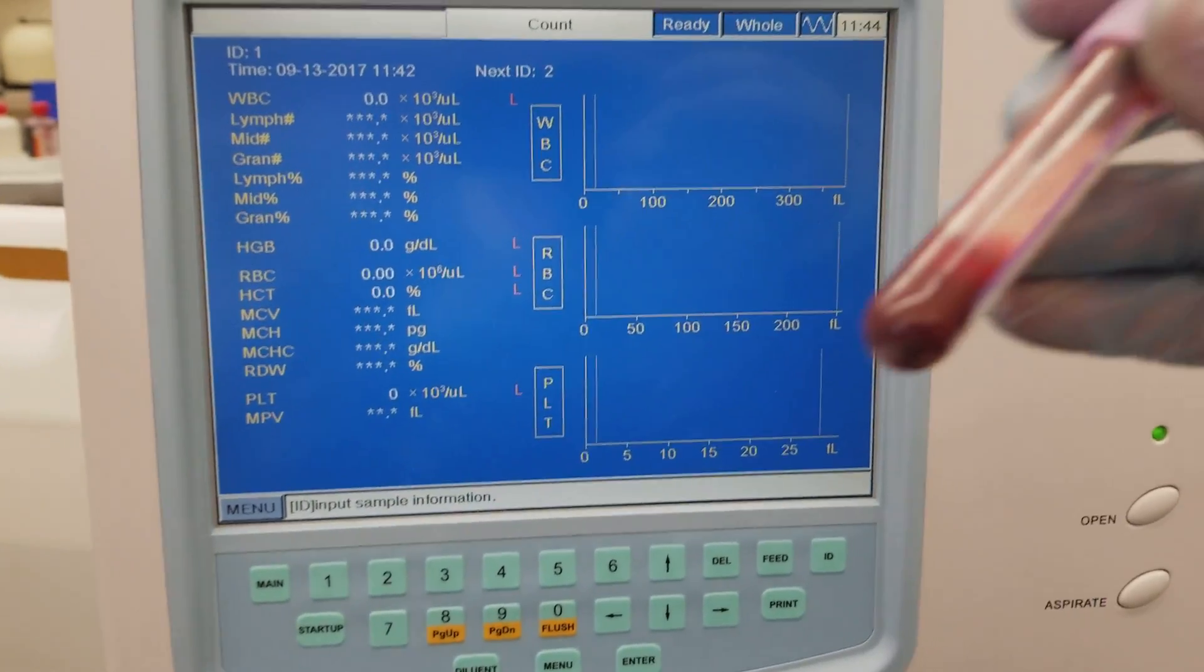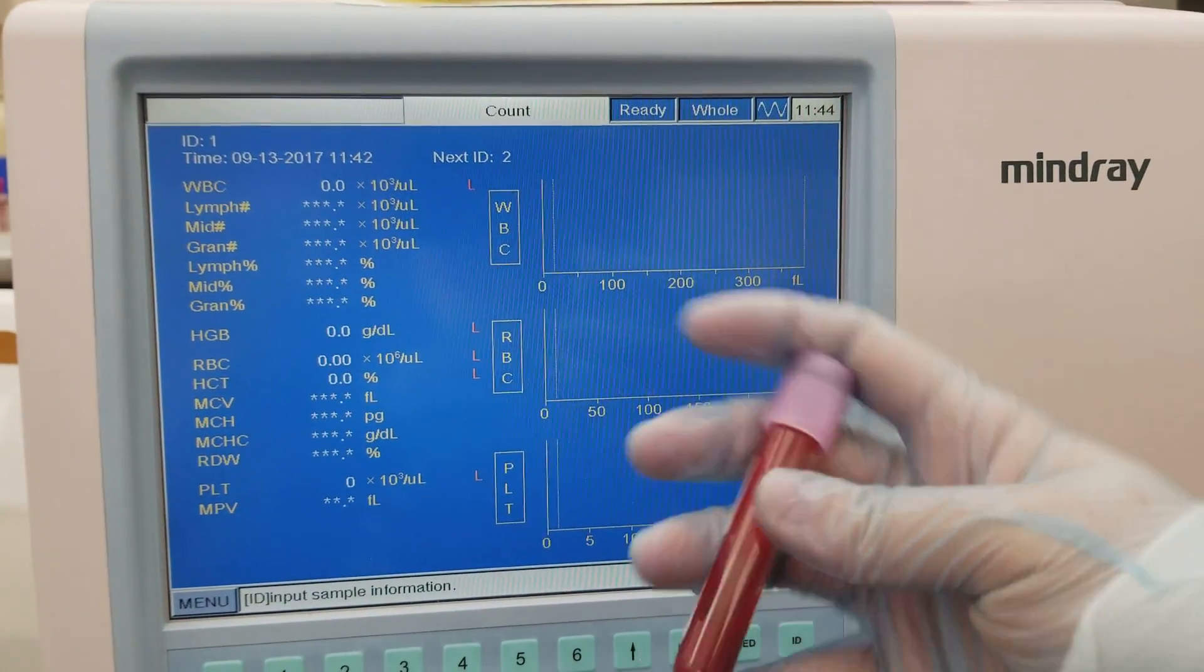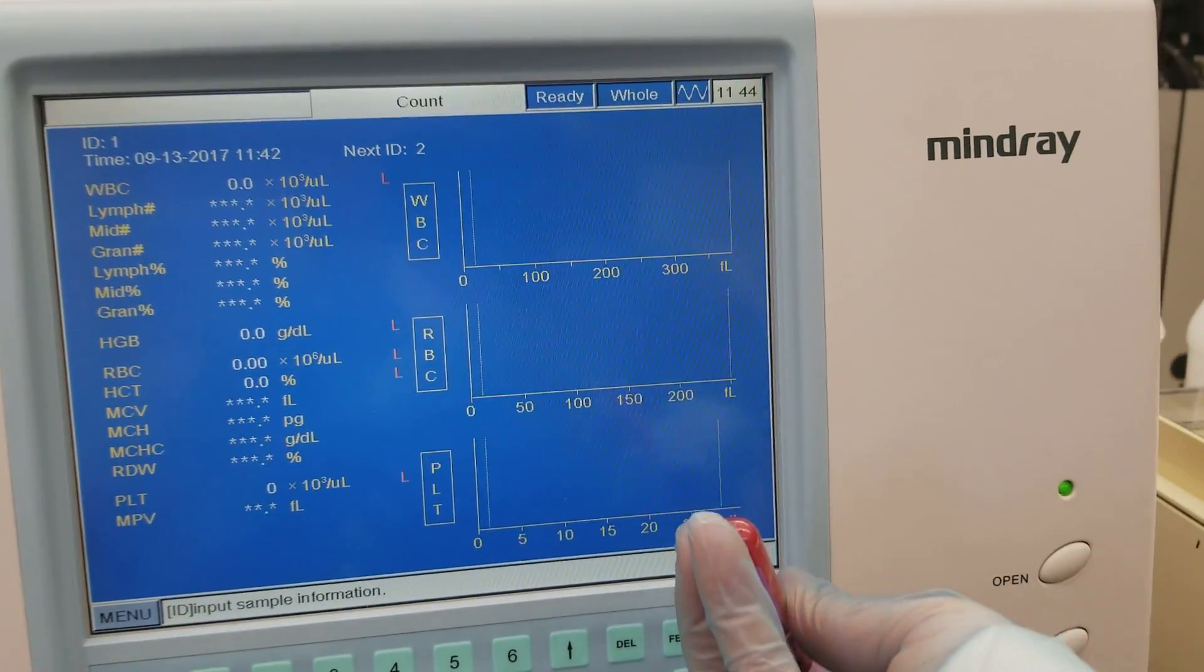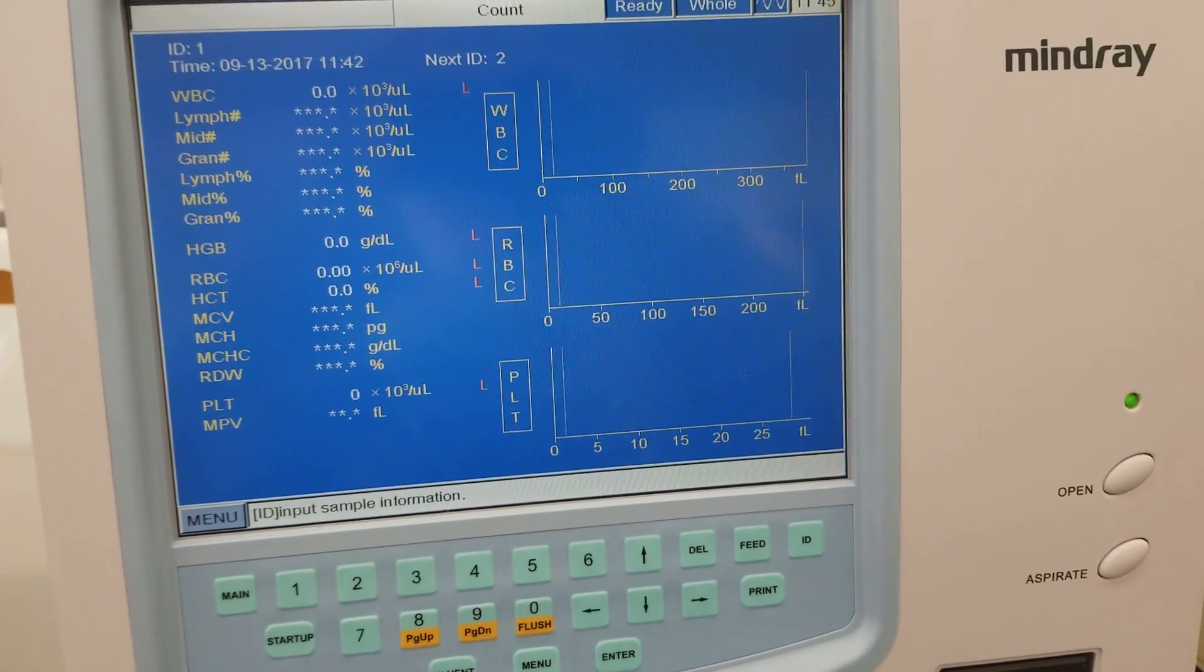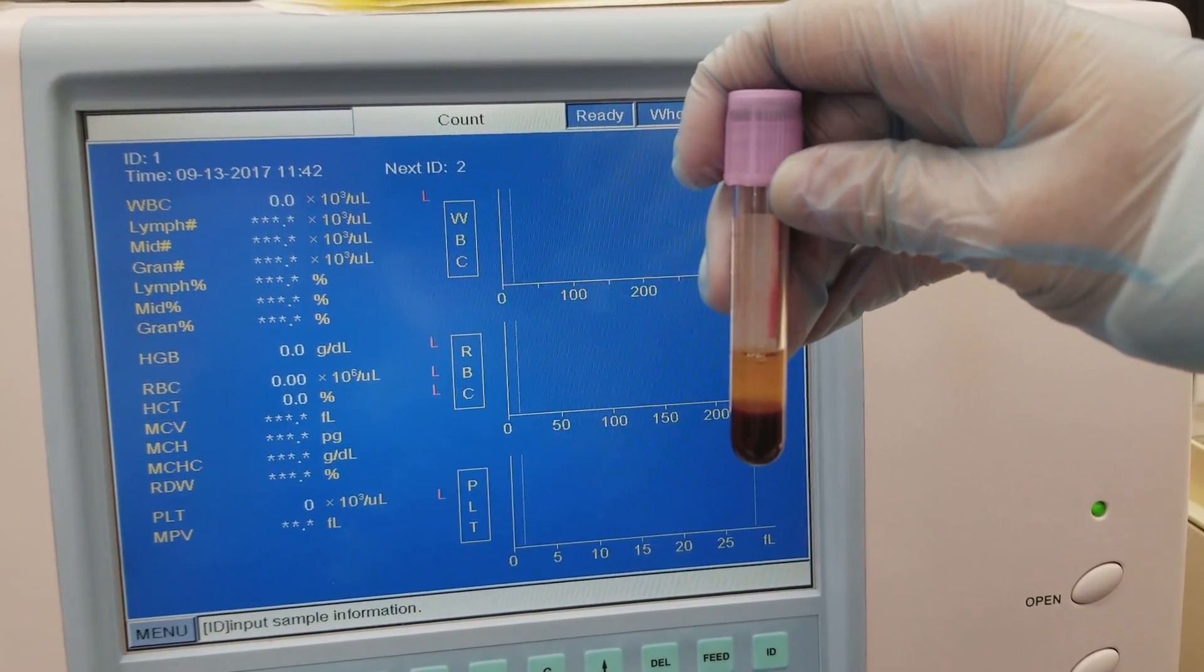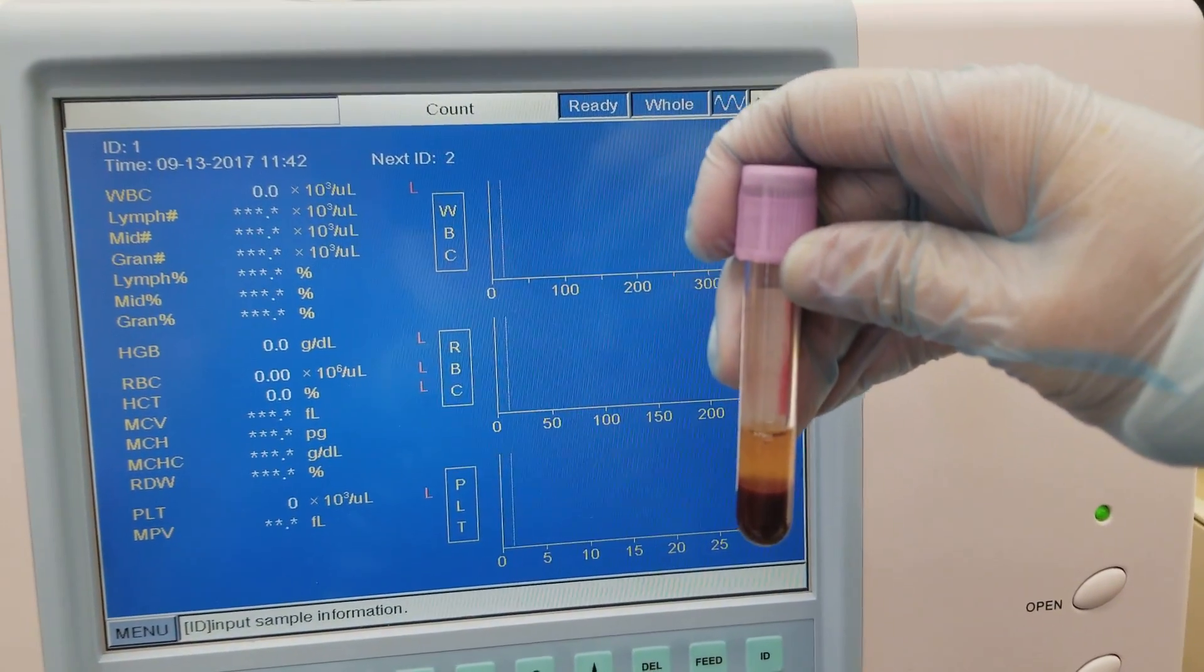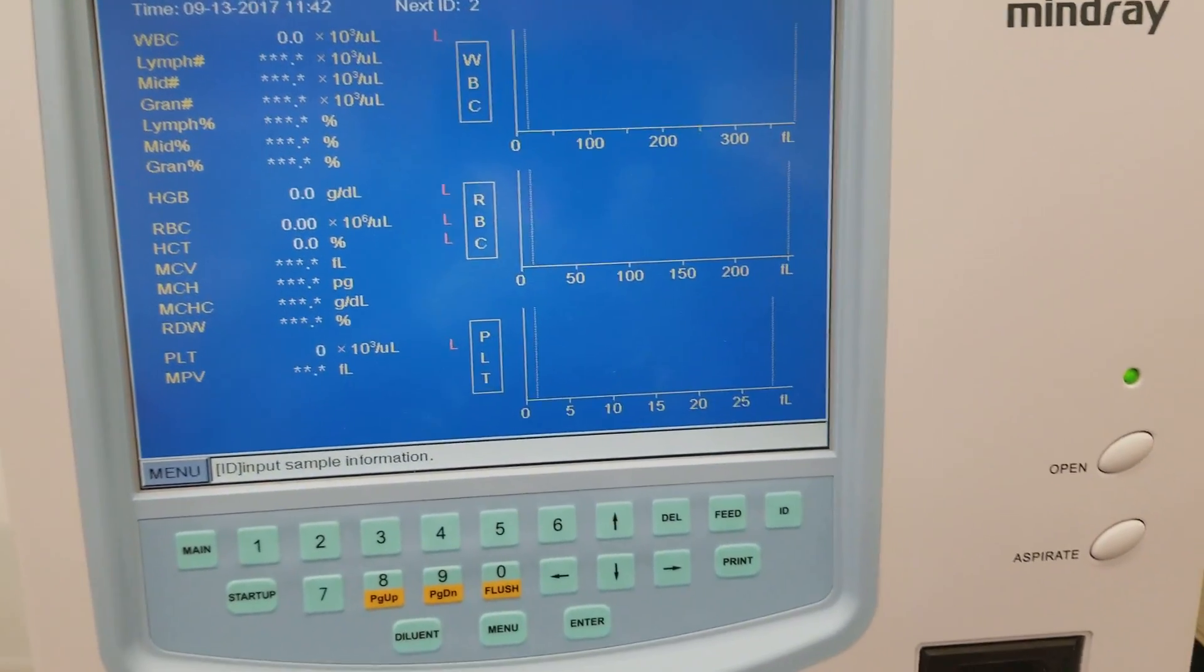I have a patient sample here. We run lavender top tubes on this analyzer, which is an EDTA whole blood sample. You want to make sure you rock gently, not vigorously, because you could cause hemolysis. If you have a specimen that has been sitting, it would separate and you would have the plasma on top and the cells on the bottom. I know that's plasma on top because this has the anticoagulant EDTA in it, which means it should not have clotted. Therefore, we know that would be plasma as the liquid portion of the blood.